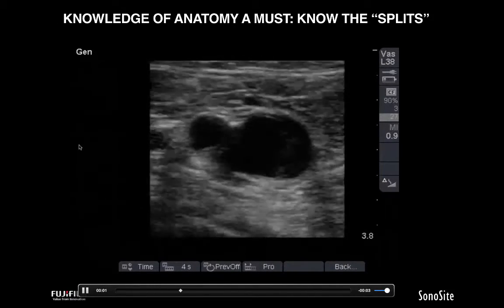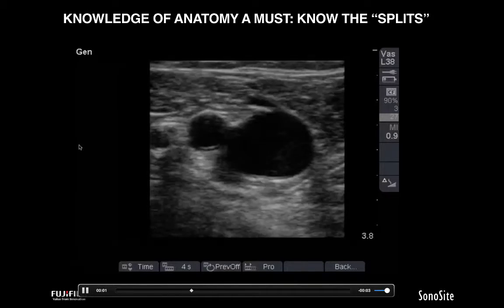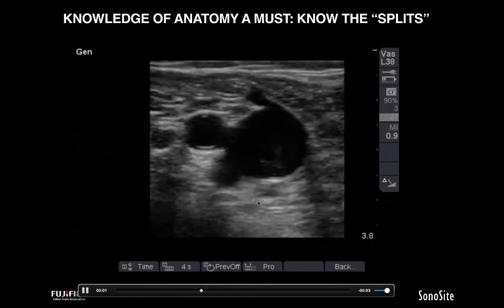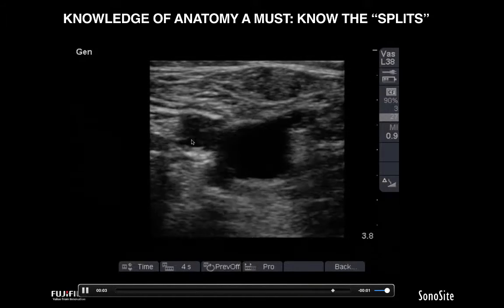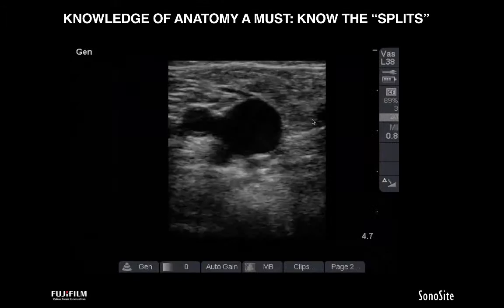Okay, so that's the upper confluence here. So this is the common femoral vein at the inguinal ligament down to where the greater saphenous inserts medially. Again, if you don't know this at home, this is a right leg, right? Because the greater saphenous is always medial and the arteries are lateral. So this is the right leg, again, greater saphenous vein.